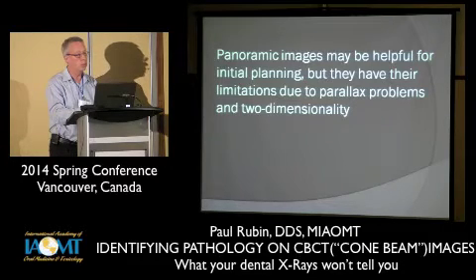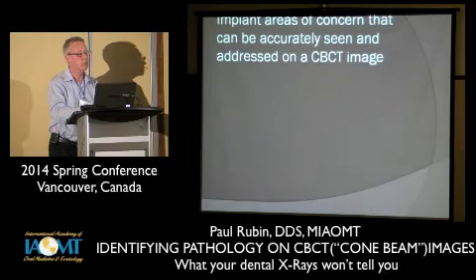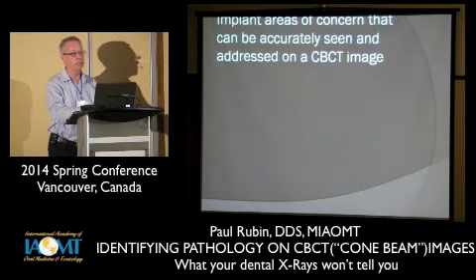Panoramic images are helpful, but they're limited. They have parallax problems, and they're two-dimensional. You can't see what's going on three-dimensionally. So here are some things you should be concerned about before doing an implant that you can address on a cone beam image.